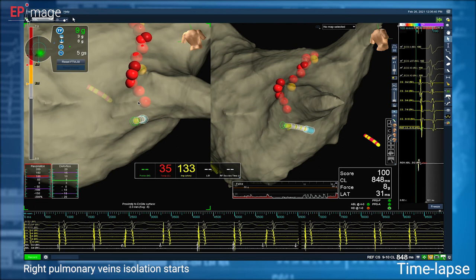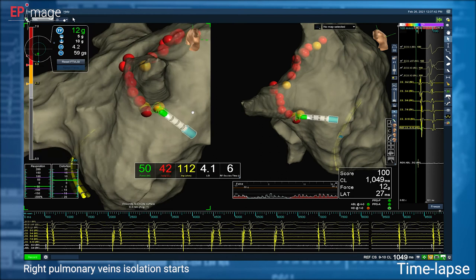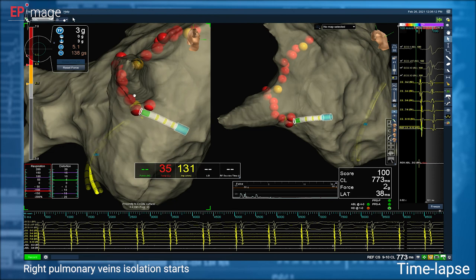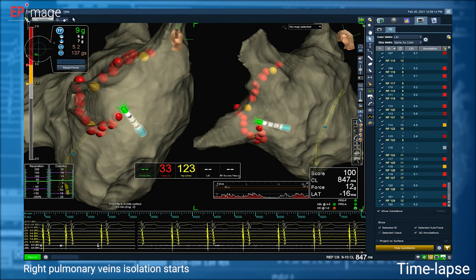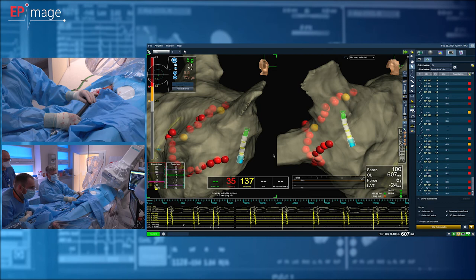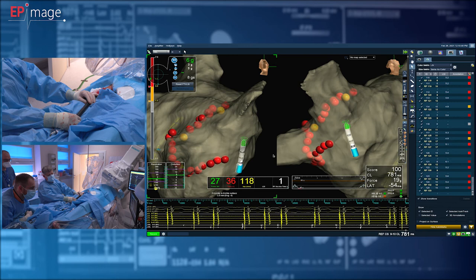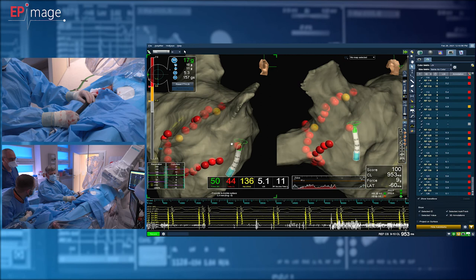But the distance from right to left pulmonary veins is so big that sometimes you don't have to jump on the posterior wall on the right or left side, depending on where the patient reports the pain. So in this case, you notice that I was not jumping on the posterior wall as I was doing when ablating around the left pulmonary veins. That's because the patient didn't report any pain on the posterior wall. Our conclusion was that we are far, far away from the esophagus. And that's the benefit of a patient who is alert and in full contact with you.